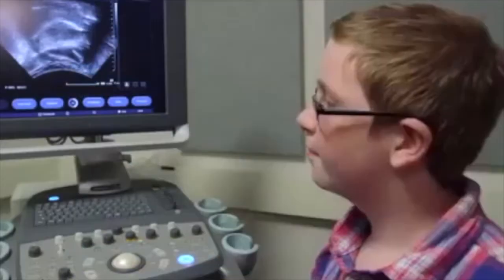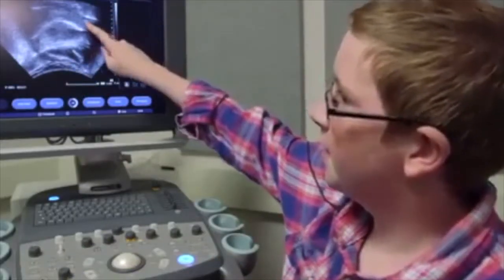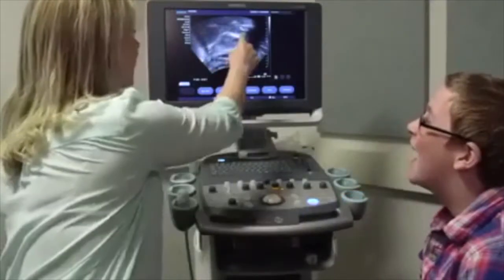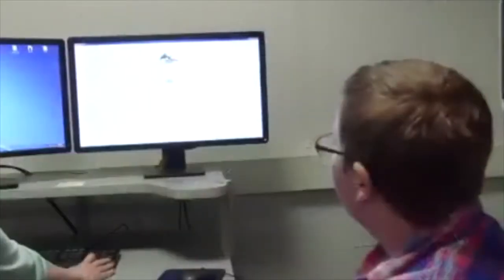Then, ask him or her to provide an explanation of what they did correctly or incorrectly after some of the attempts. After the participant produces the correct sound, press the pause button to freeze the frame and discuss how this correct image looks different from previous incorrect productions.